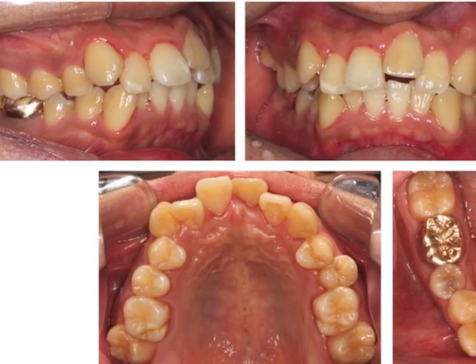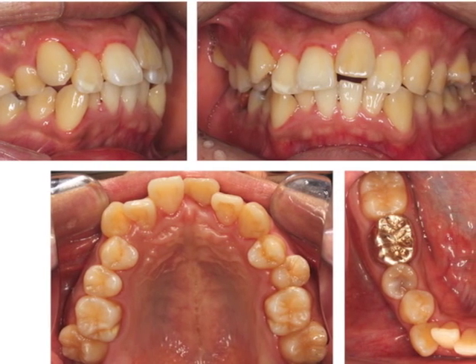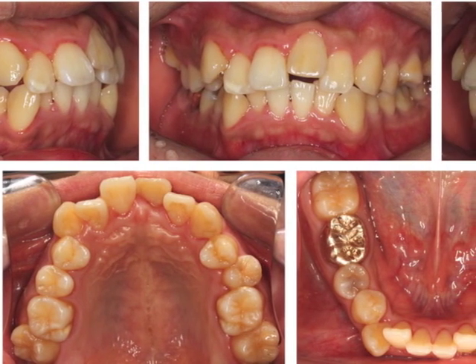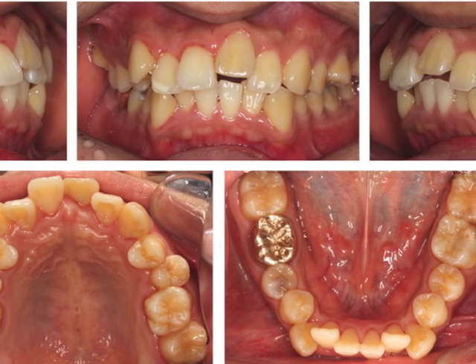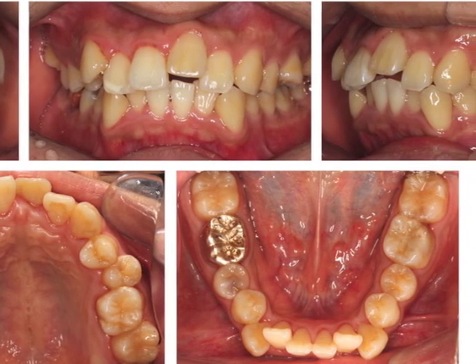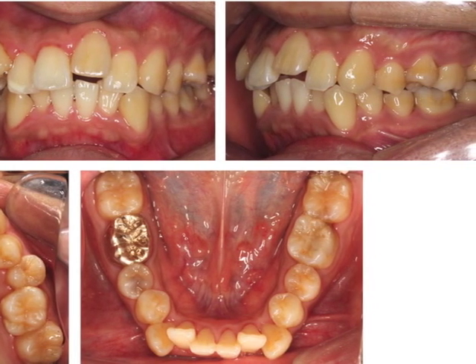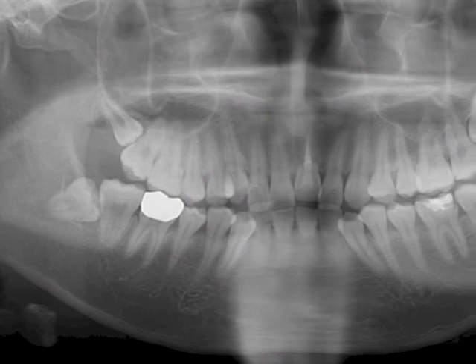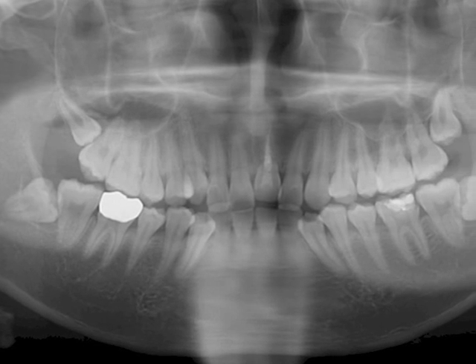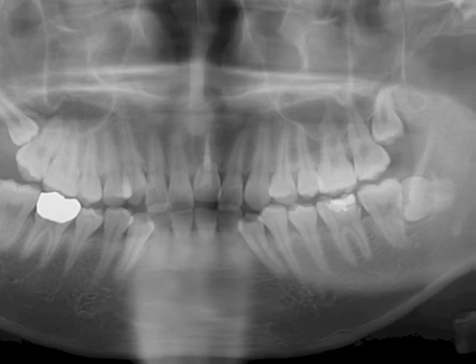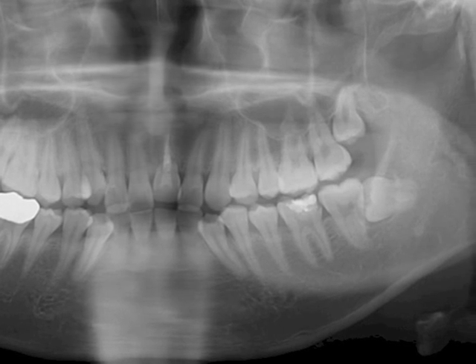The patient is a 22-year-old man who had a chief complaint of crowding. Because of childhood trauma, the maxillary left central incisor had been avulsed and was replanted. Since that time, the affected central failed to erupt normally, showing signs of ankylosis. The panoramic and periapical radiographs confirmed the presence of replacement root resorption, even though the endodontic treatment had been completed following replacement of the tooth.